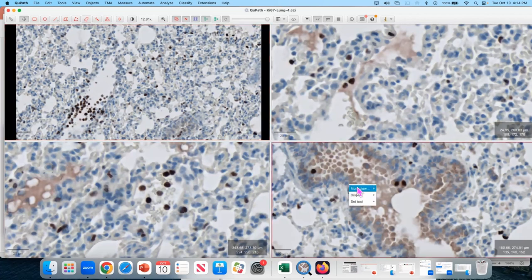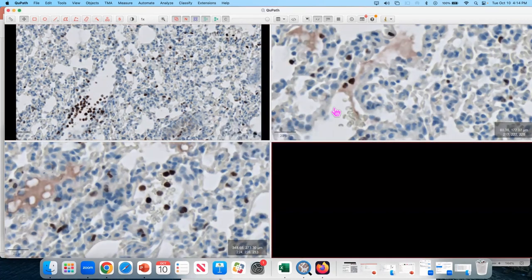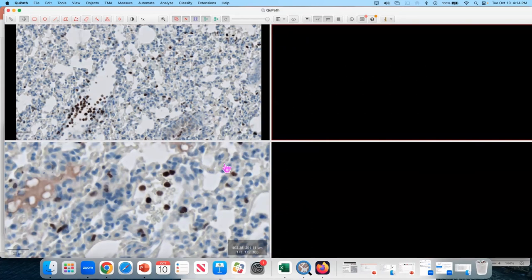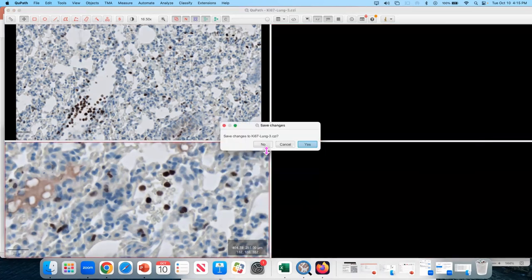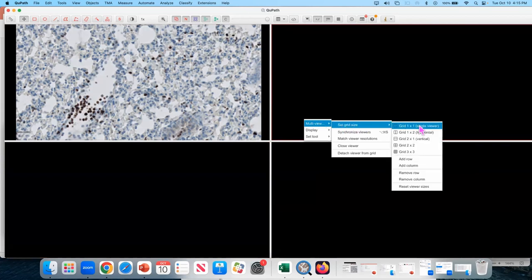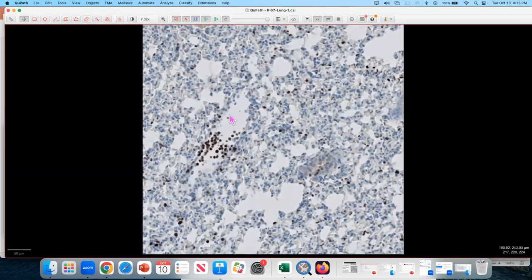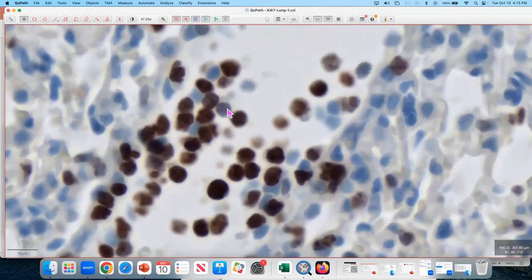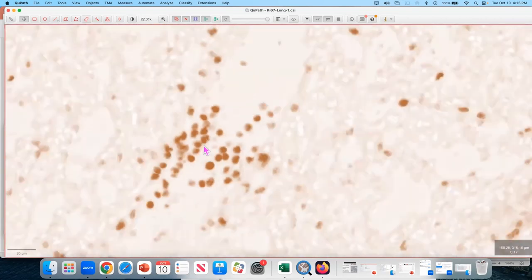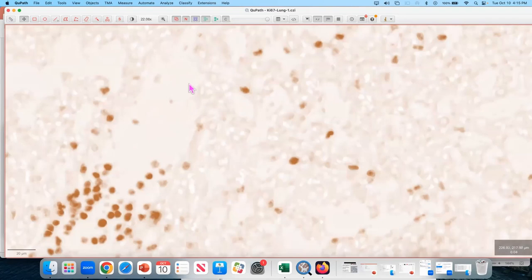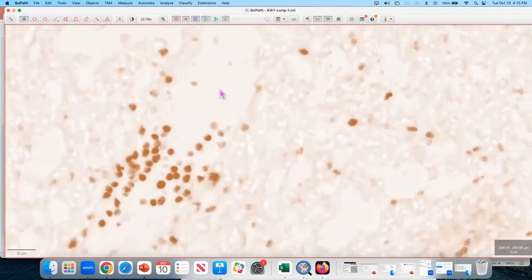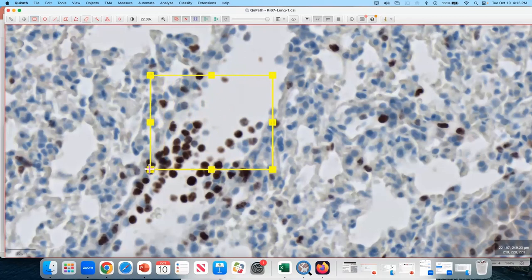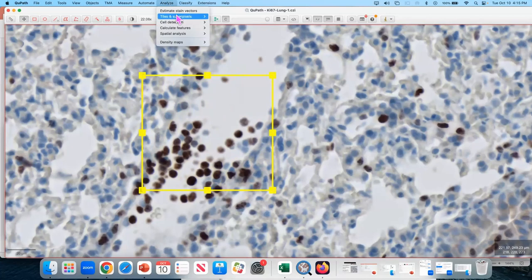So to make my life easier, I'm going to close those viewers so I have just one. I can save the data. The only thing I did is I applied color deconvolution that was the default. And I am actually going to change that color deconvolution a little bit. It might be that it's not really great for the sample. So if I press 2, I'm getting pretty good hematoxylin. So that DAB image is looking pretty nicely, but there is quite a bit of background that I would like to get rid of.